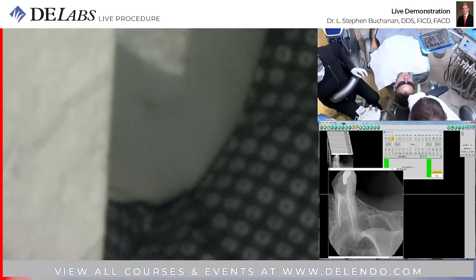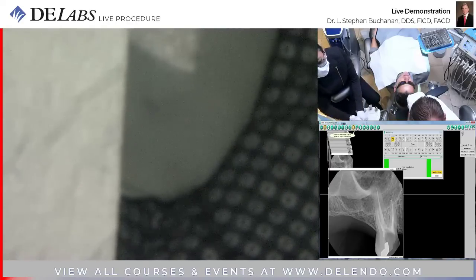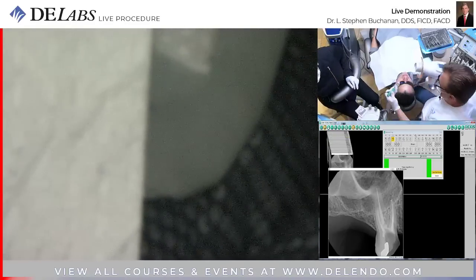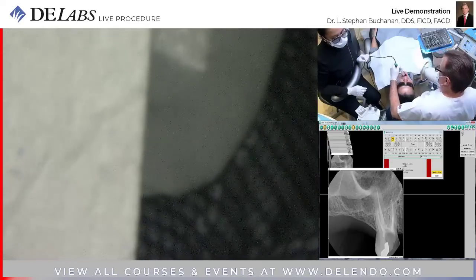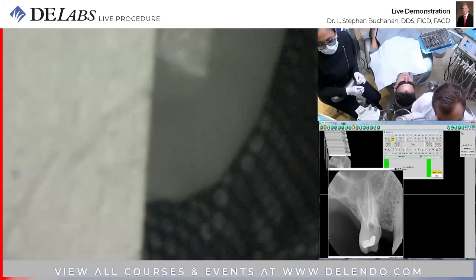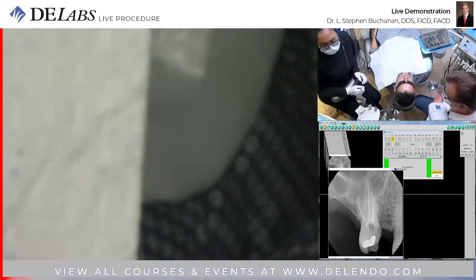Oh, okay, not bad. You can see a little bit of the MB2 there. I'm going to take a real mesial view here. It's hard to see. Let's get a 40 by 40.